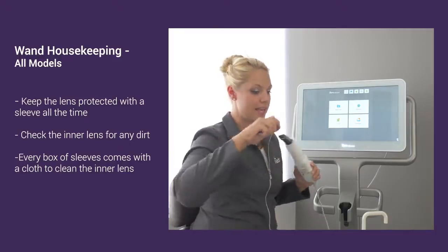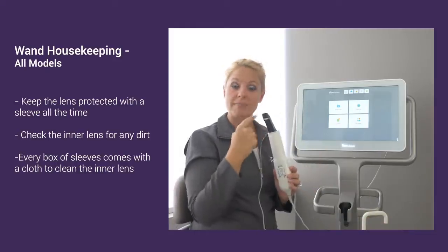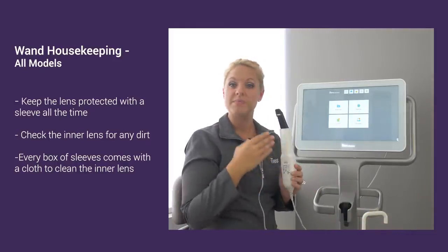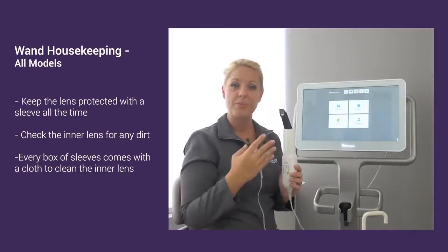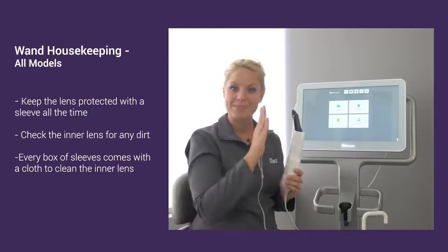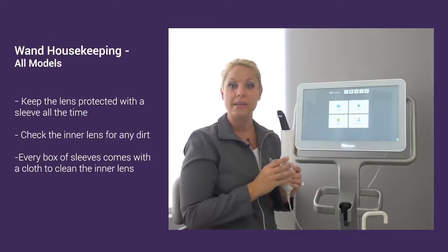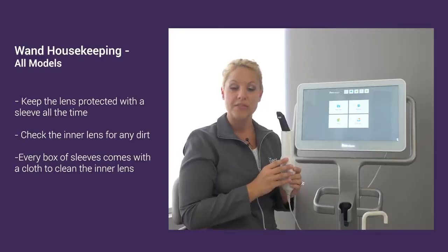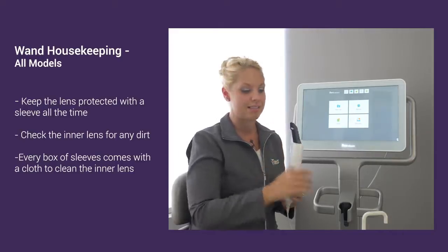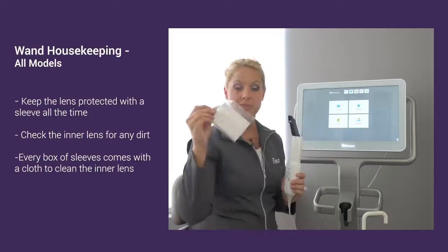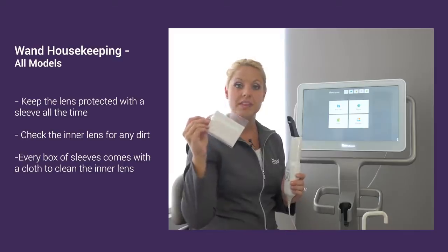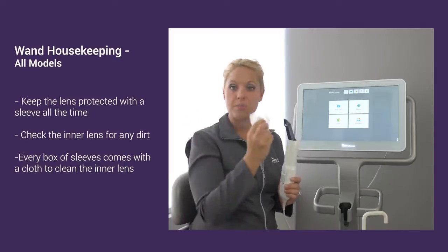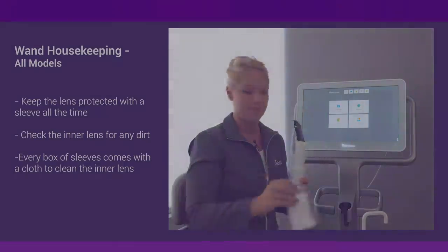With the inside lens, double check to make sure that we don't have any smudges or fingerprints or perhaps any wipes that got on that inside lens because it will affect the quality of your images. If you ever do have any smudges, every box of sleeves provides a lens cloth that you can use dry to rub away any smudge that may occur.